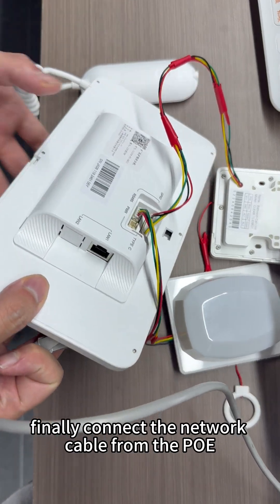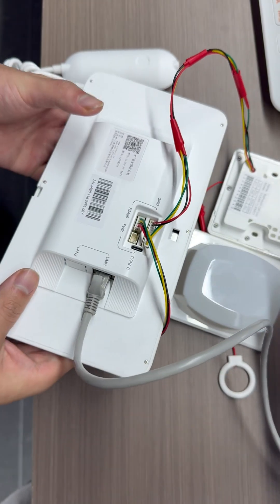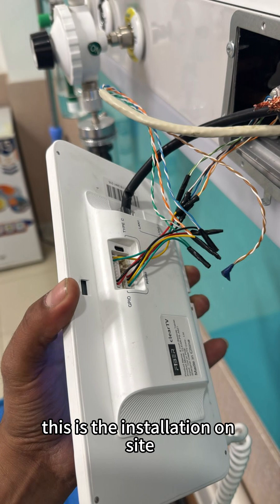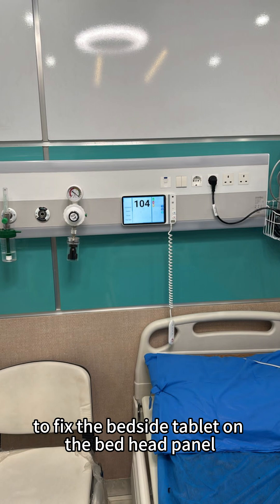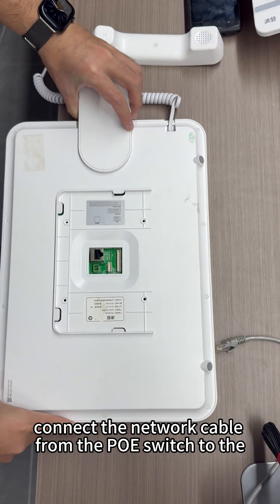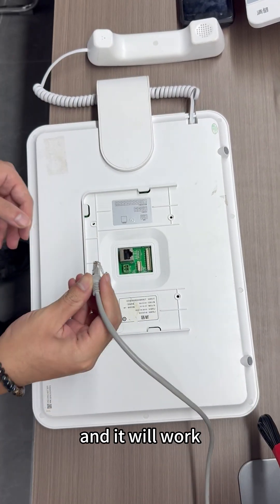Finally, connect the network cable from the PoE switch to the bedside tablet and it will work. This is the installation on site. We will provide a wall-mounted bracket to fix the bedside tablet on the bed head panel. Connect the network cable from the PoE switch to the nurse call host and it will work.